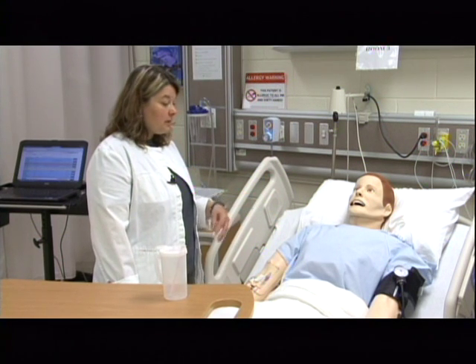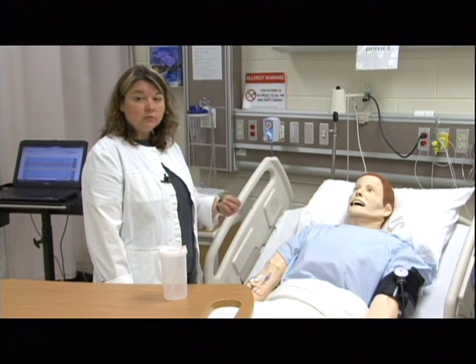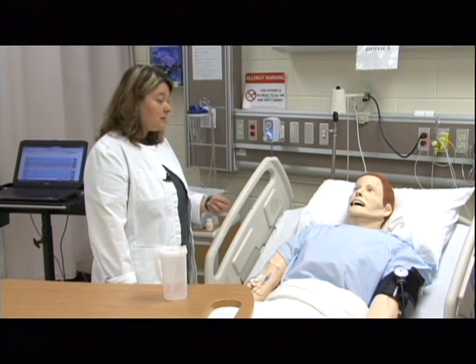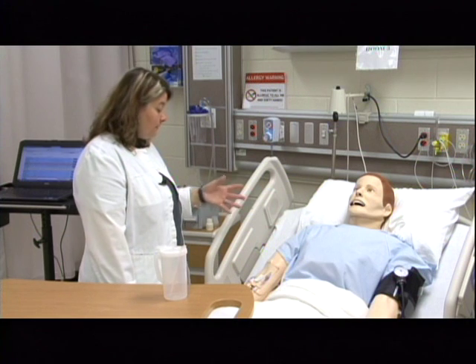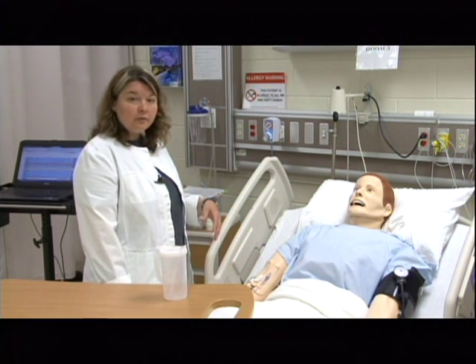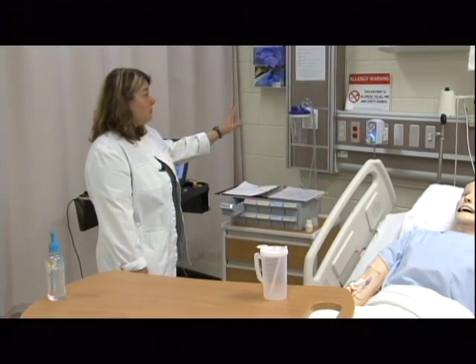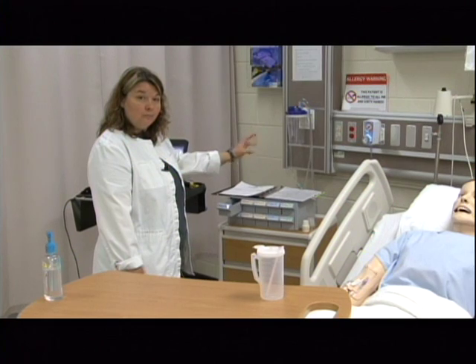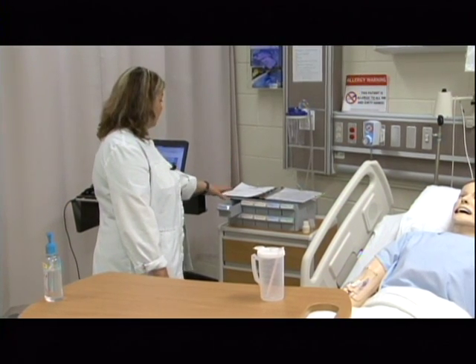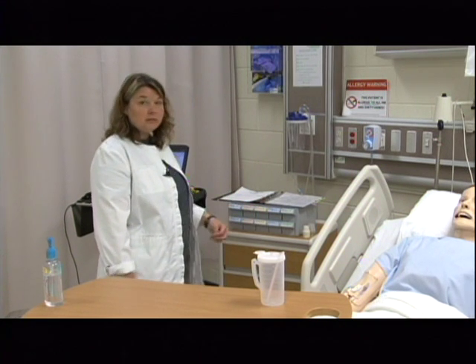So I've already done all my pre-assessments, and I need to know what the medicine is for, or the right reason. I need to have done the assessment data, and I need to know if he is okay with me administering. He said he's fine with that. So now I'm going to go ahead, and I'm going to move over here to where the medications are kept. In most facilities, you will probably have a locked box on the wall, or they will be kept at the patient's bedside in a locked manner. So these drawers would be locked and closed and all of this kind of stuff.